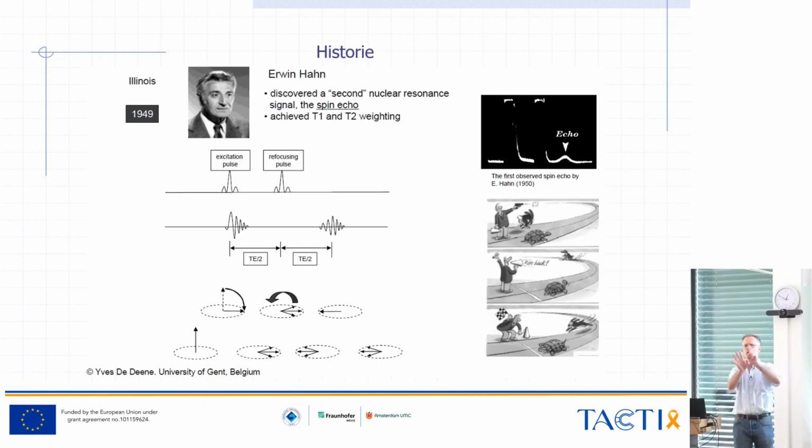So all the spins which were in front before are now lagging behind and have to recover, and those which had been lagging before are now ahead, and they have a little bit more time, and then they will just reunite after the same distance between the excitation and the refocusing, and give you what's called a spin echo, because the spins are getting realigned again, and you recover everything which was constant between your start and your spin echo time.